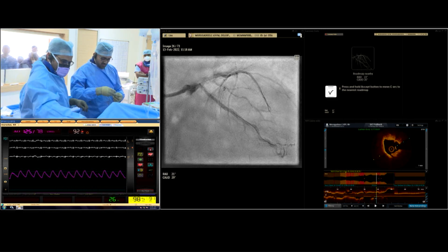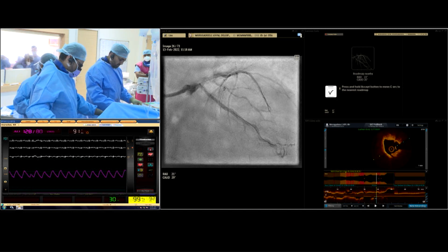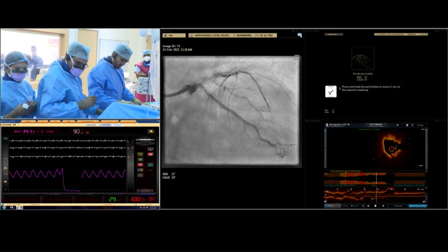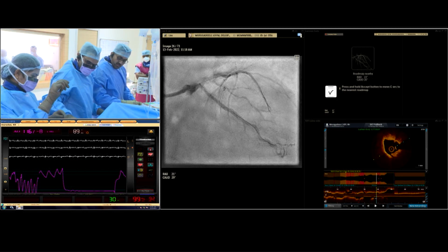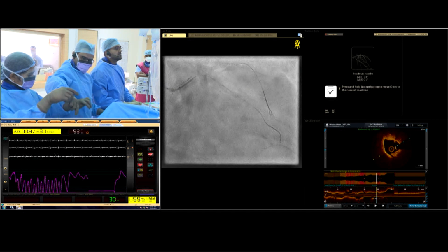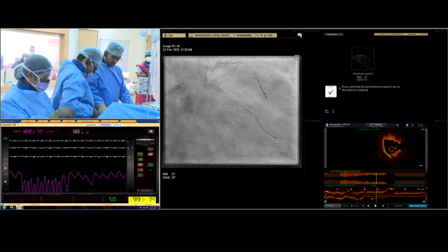Ellen, your inputs. Yeah, the stent circumflex, next. I think imaging really helped. We didn't know that the distal circumflex lesion was really tight, but OCT clearly showed us that that also has to be treated. And so, having centered the distal stent in the mid circ, and now coming to deal with the bifurcation of the right side, imaging helps to take the right decision.